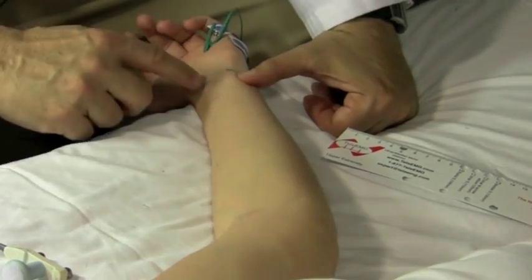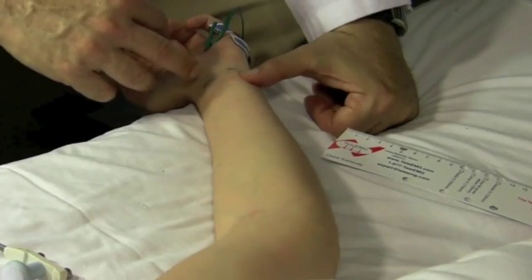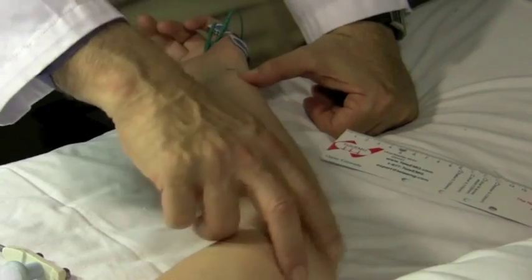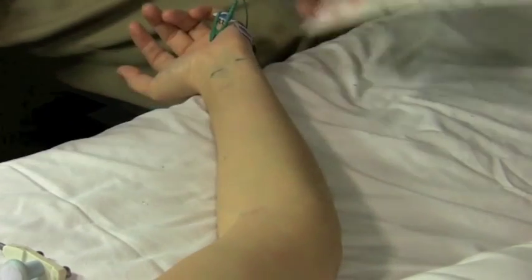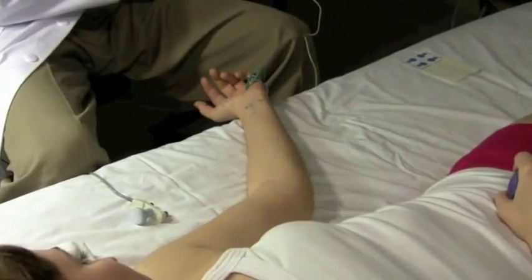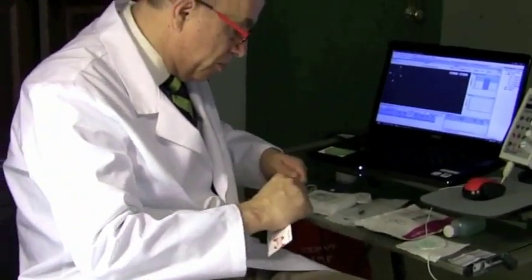So for the median nerve, I stimulate in two places if I need to. I stimulate at the wrist, and if I need to, I can stimulate at the elbow. For the ulnar nerve, I always stimulate at three places: wrist, below, and above the elbow. And again, I use set distances, and the set distance across the elbow is 12 centimeters.